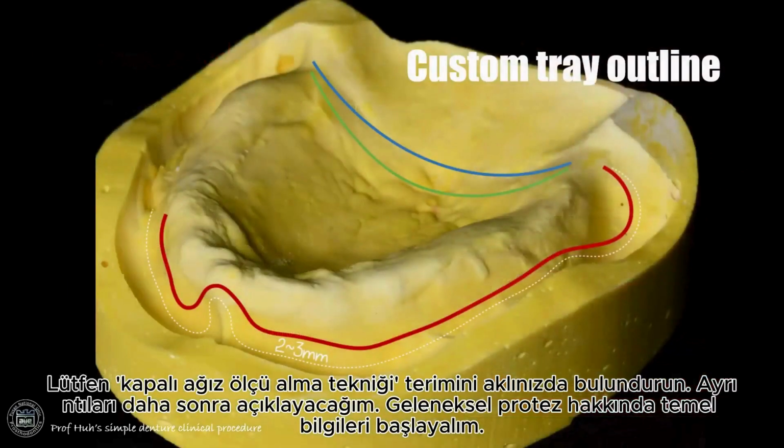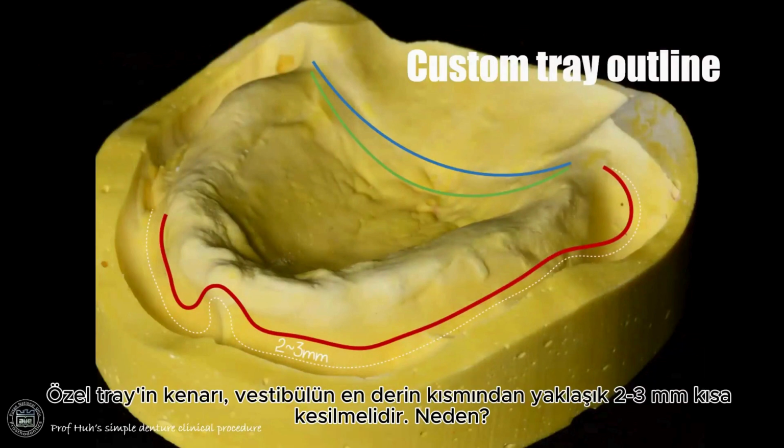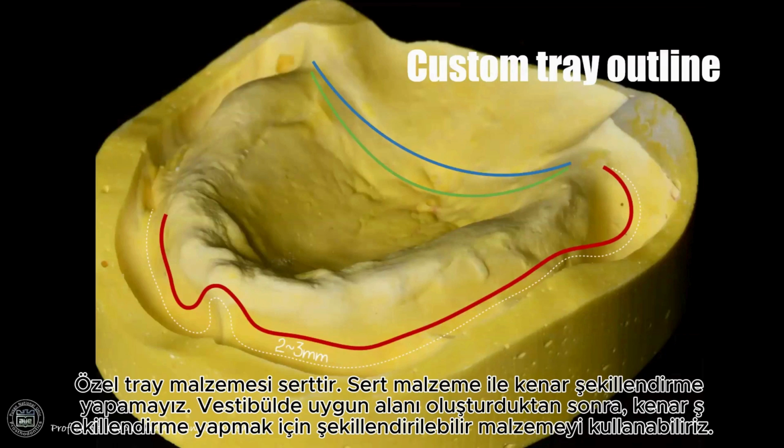Okay, let's start with the basic knowledge about the conventional denture. The border of the custom tray should be trimmed approximately 2 to 3 millimeters short of the deepest part of the vestibule. Why? Custom tray material is so hard. We cannot do border molding using hard material, right? So after making proper space in the vestibule, we can use a moldable material to do border molding.